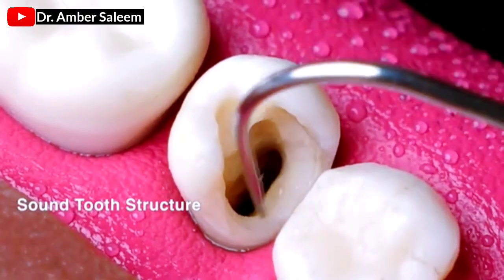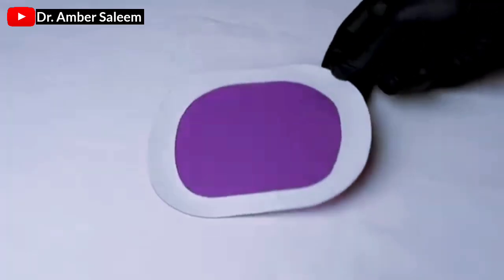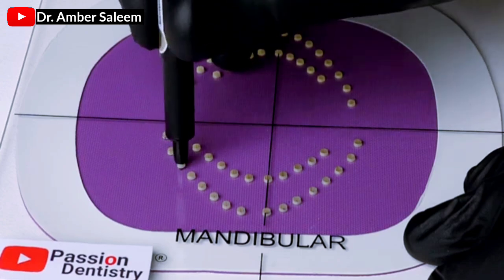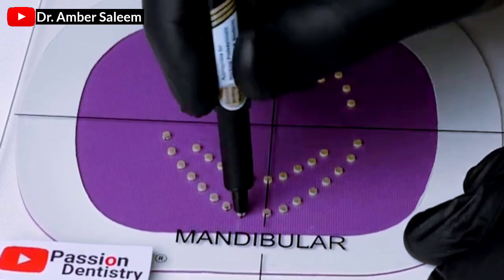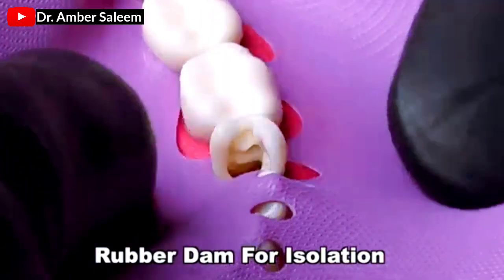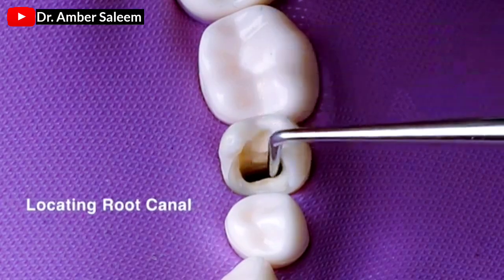Sound tooth structure. Rubber dam for isolation. Locating root canal.